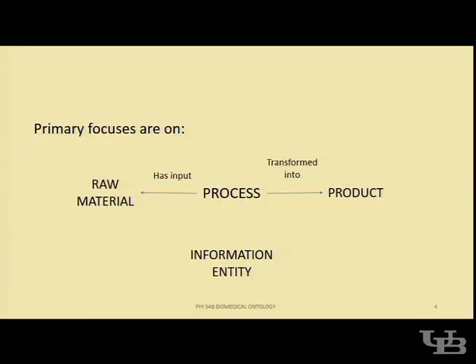Because these are specific applications of the additive manufacturing process, my ontology that I'm developing is focusing more on the processes that require the material to produce the product and require certain data information entities to support the process.